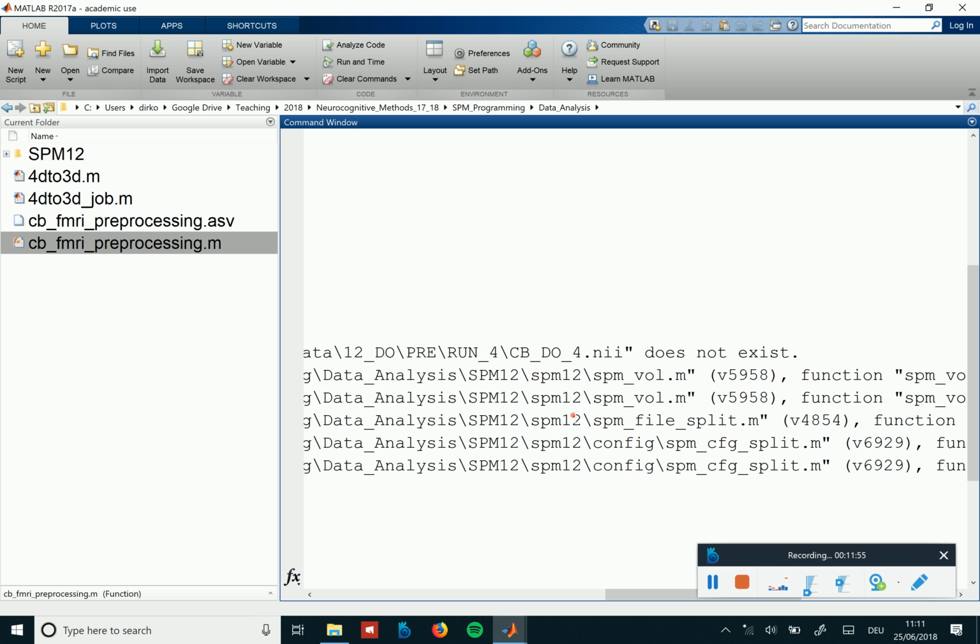You don't want to store the intermediate files. You want to have the raw data and the script, and the script essentially holds all the information that is done as transformations to the raw data, and then you can delete all intermediate files at one point.